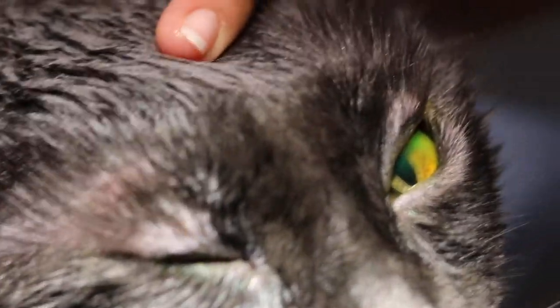After irrigating the eyes, we put fluorescent eye stain to check for corneal ulcer. As you can see, that is the green — the cornea is stained green at the upper side.